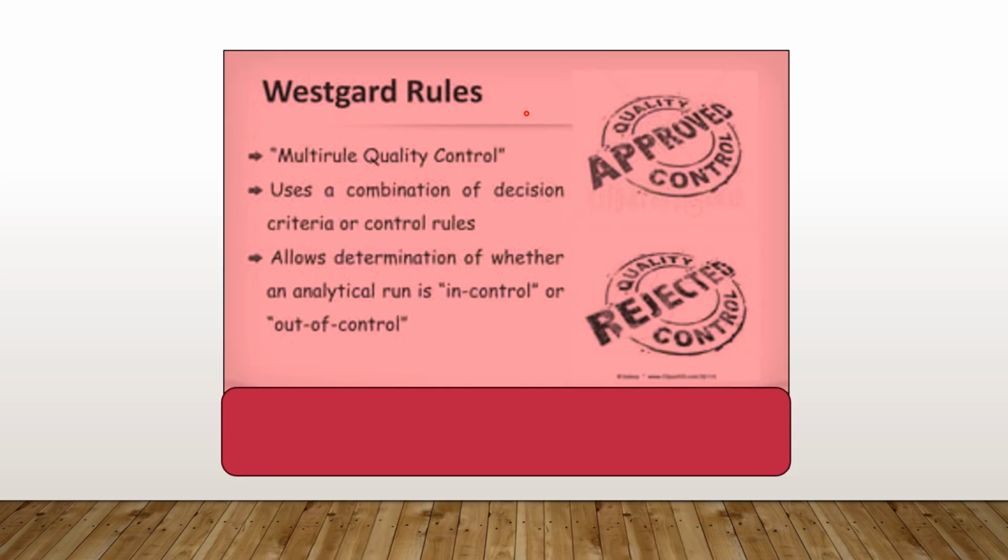Then what are the Westgard rules? It is a multi-rule quality control.